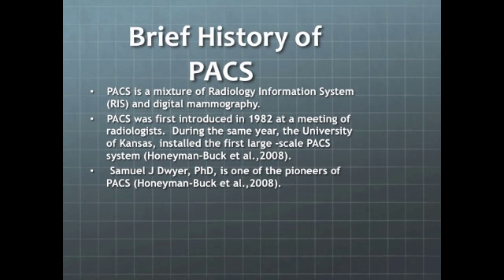PACS is a mixture of radiology information systems and digital mammography. PACS was first introduced in 1982 at a meeting of radiologists. During the same year, the University of Kansas installed the first large-scale PACS system.